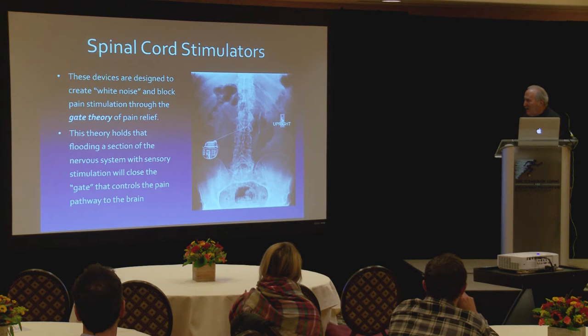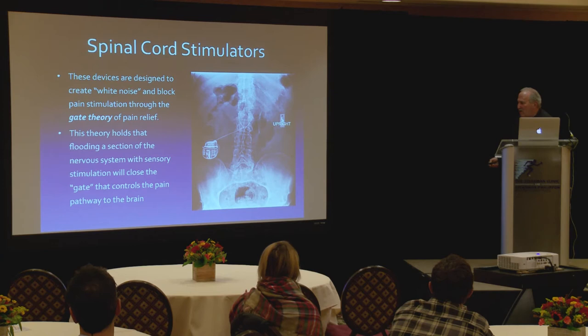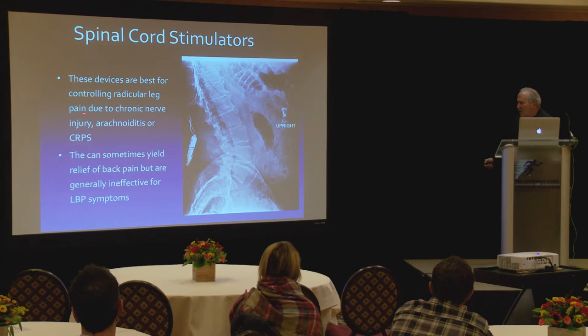They're designed to create white noise, as I said, and you flood a section of the nervous system with sensory stimulation, and you'll close the gate that controls the pain pathway to the brain. And it's harder to see, but there are little electrodes on each of these two leads, and they can be stimulated in different patterns. And that's what these spinal cord stimulators are designed to do. They're best for controlling radicular pain, as I said, chronic nerve injury, arachnoiditis, or CRPS. They can occasionally give some relief of back pain, but generally are ineffective for back pain symptoms.